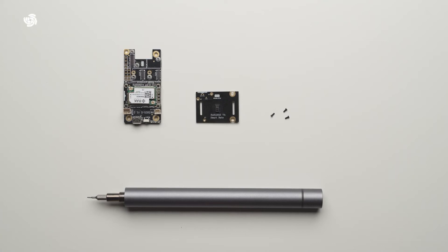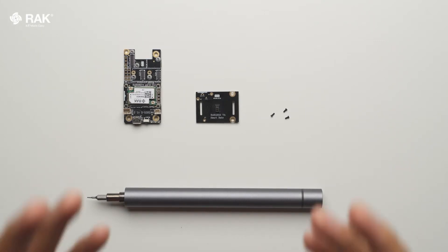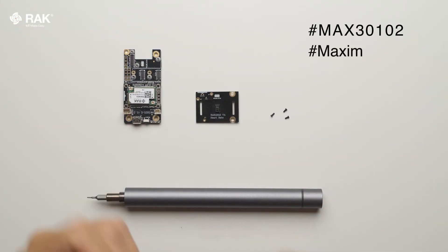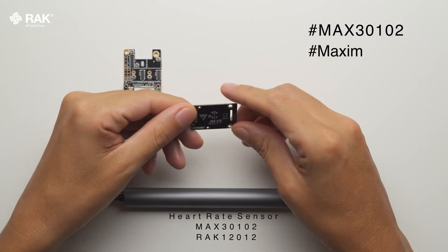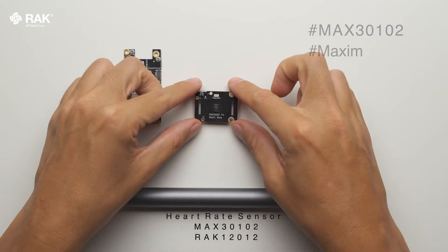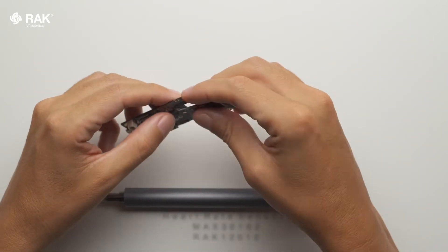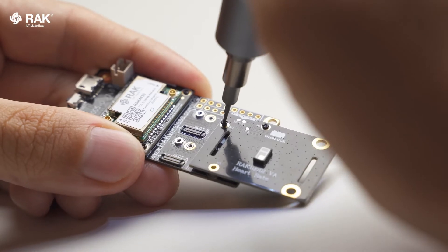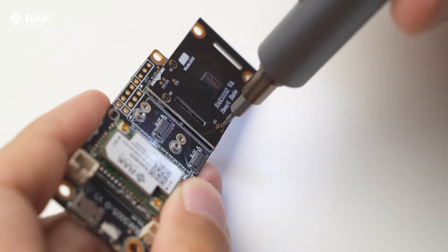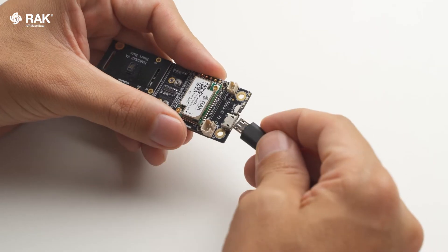How to set up a heart rate sensor with Arduino. In this video I will use the RAC 12012 heart rate sensor. Attach the RAC 12012 onto the WisBlock Base and Core.